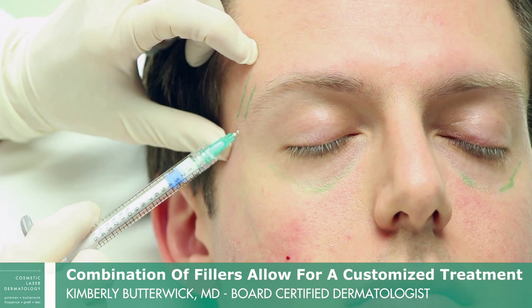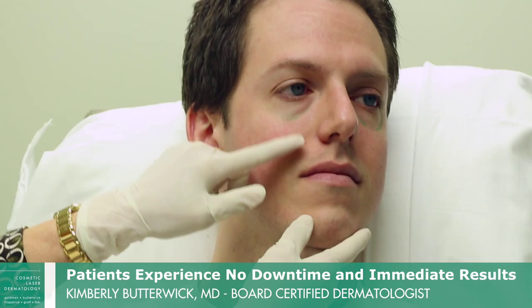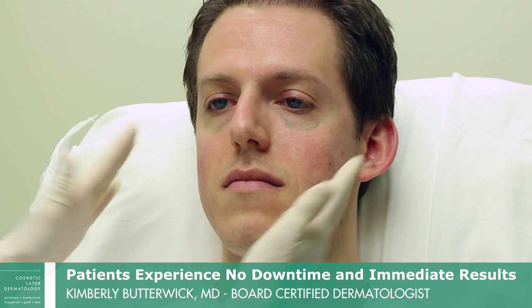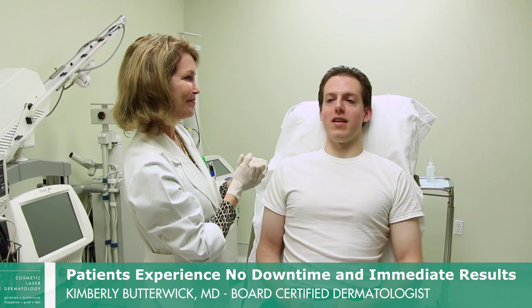And then I'm going to put a little bit in his temple now. You can see his temples are a little more filled in. This area that was so flat now just has a little volume in it, and there's a little more volume in his cheeks — it's like he used to look a little bit younger. It just took small quantities to get a big correction on someone this age.